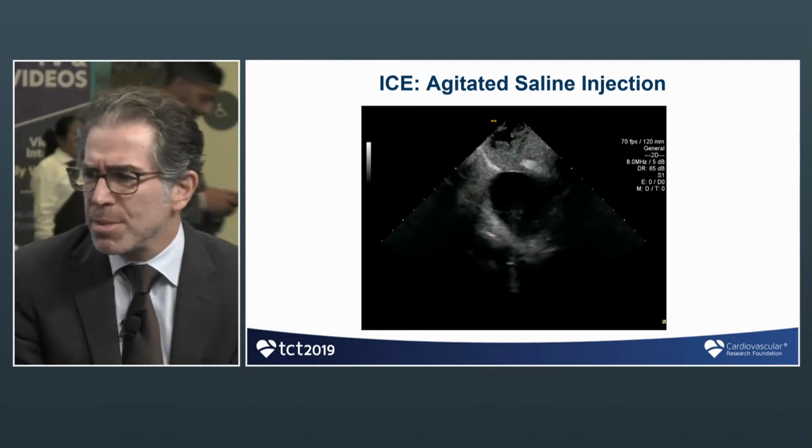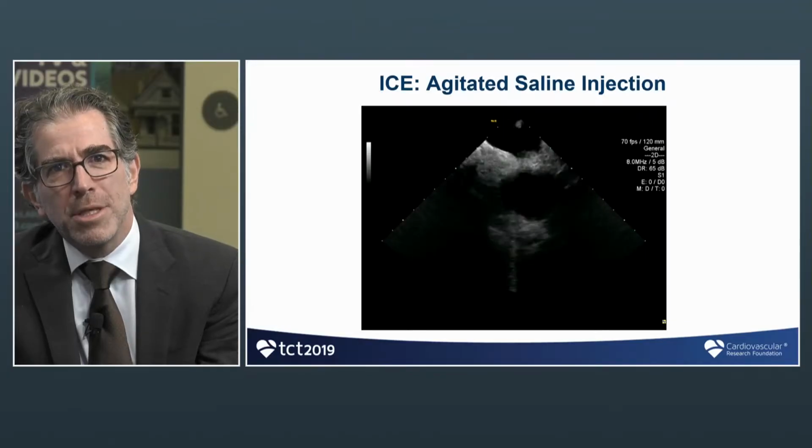How do you define a thick septum secundum? Is there a number you use, John? Yeah, over 1 centimeter. Over 1 centimeter. So we've had some as big as like 2 and 2.5. Oh yeah. They create very unusual challenges because there's not a good device to close all of them. Right. We'll talk about some techniques maybe to do that with the devices we have. Yeah. So I would say this, if you look at it, is probably about 10 or 12 in terms of thickness. And you see also, as you mentioned, there's a large shunt.